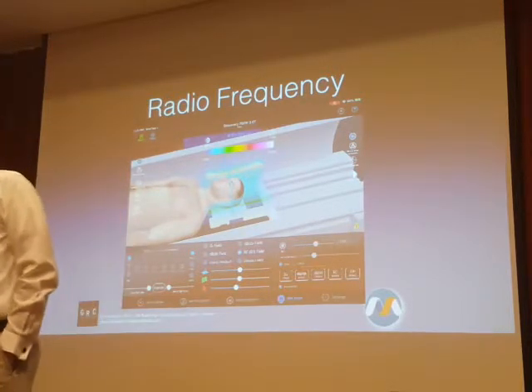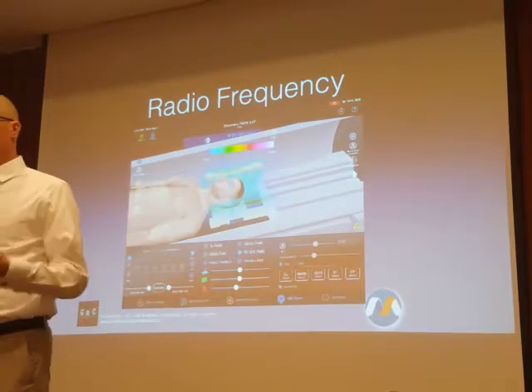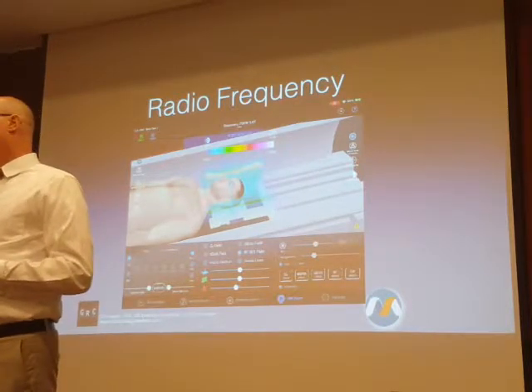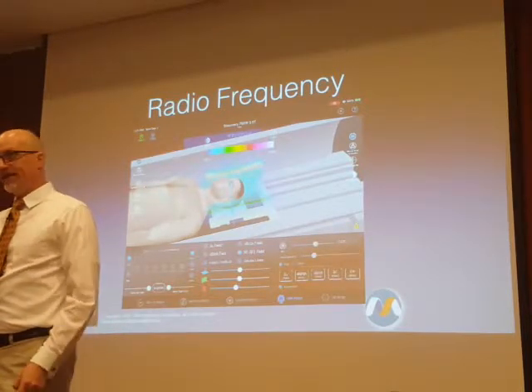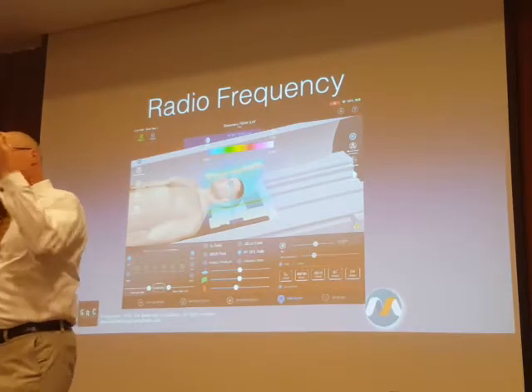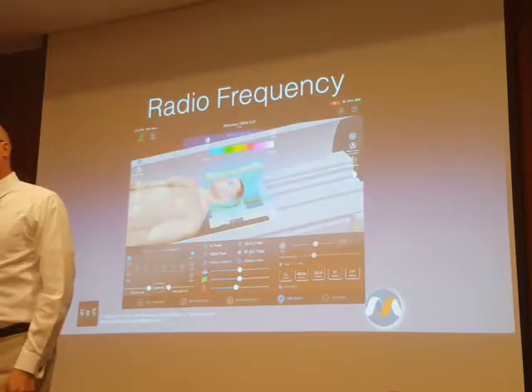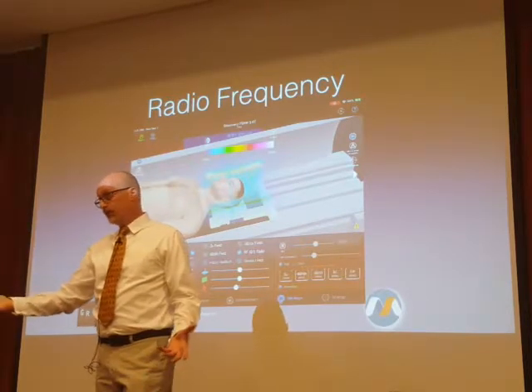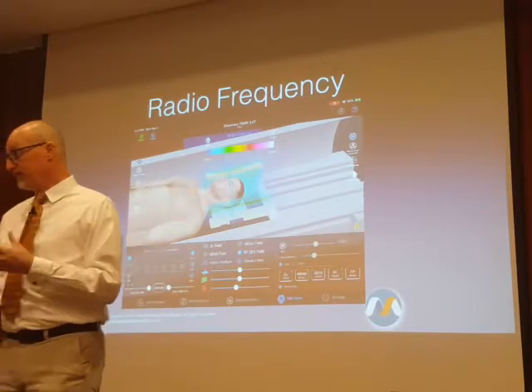We're actually transmitting more than that. 200 is what we think the patient is absorbing, so there's even more than that in terms of transmitted power. Unscrewing a 60 watt light bulb, the primary purpose of which is to take energy and turn it into light, it just happens to turn some of it into heat as well, creates enough heat that it burned my hand badly at 60 watts. Now we're talking 200 watts or potentially more than that. So the amount of power is fairly significant.